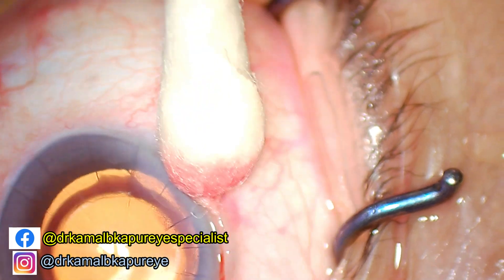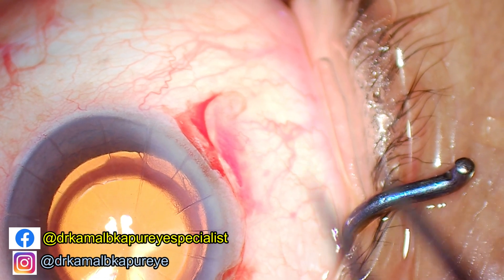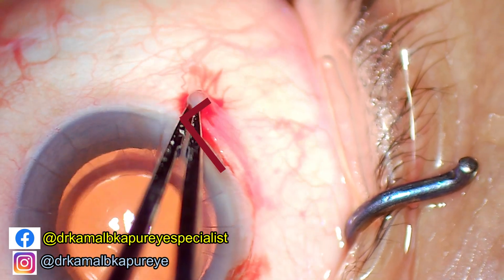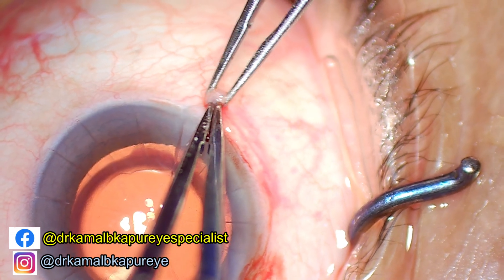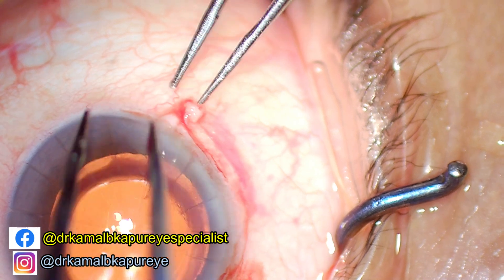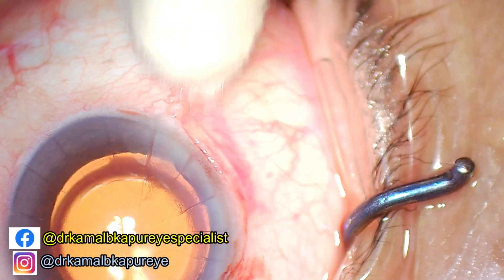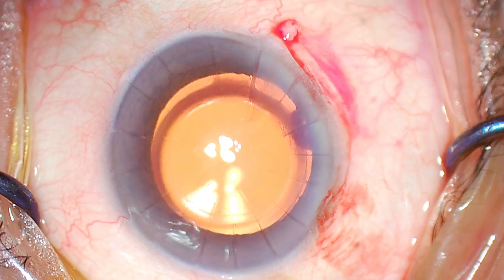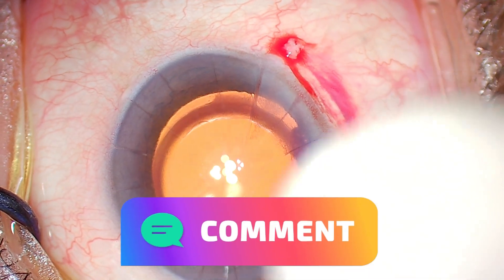We now have a decent amount of intraocular pressure. We dry the scleral bed. The apposition of the angle of the L-incision is where we now do cautery. We just hold this L-shaped angle of the conjunctiva, hold two edges together, dry it, and use just 25% cautery — slight cauterization, not heavy. The conjunctiva totally fuses. You will not need any sutures here. If you have to give a subconjunctival injection, give it away from the site of the main scleral wound and conjunctival cautery, because the fluid from the injection may cause the conjunctival flap to open up or cause intracameral leakage of the medication.